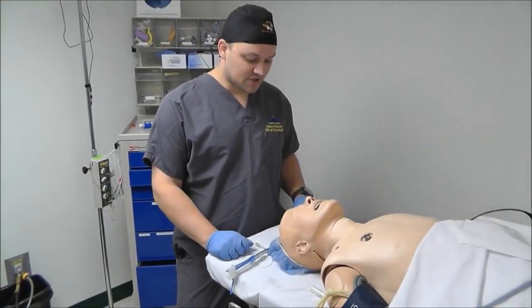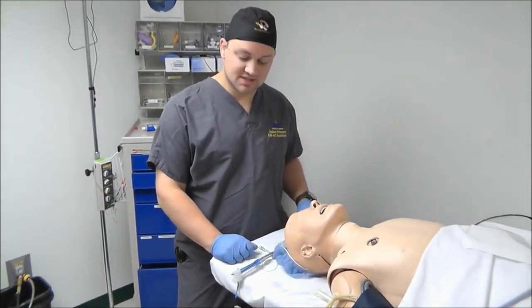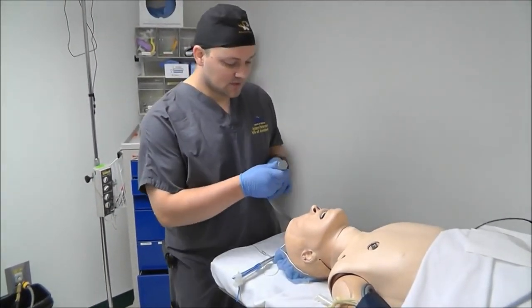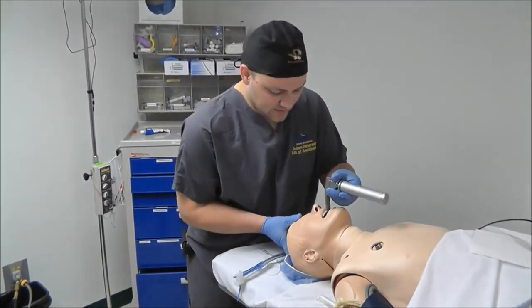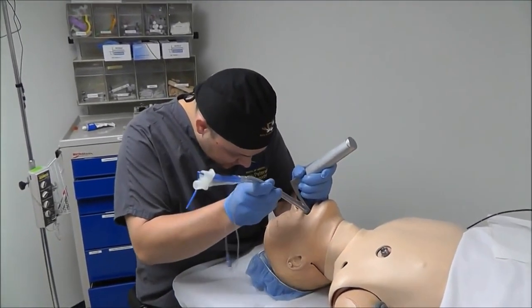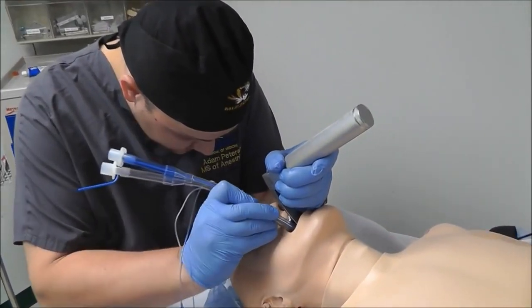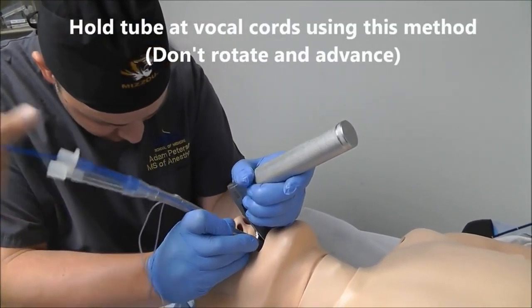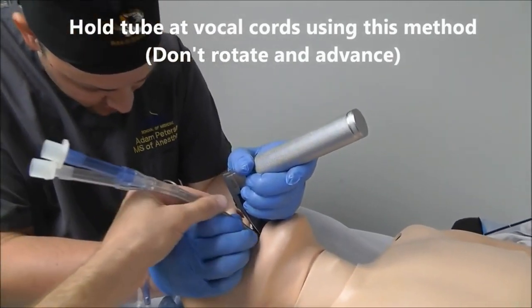The last method I want to show you in placing a double lumen tube is a combination of direct laryngoscopy along with fiber optics. Perform your laryngoscopy like normal and insert your double lumen tube in the same manner to the level of the cords. At this moment, you want to have an assistant pull the stylet and hold the tube.